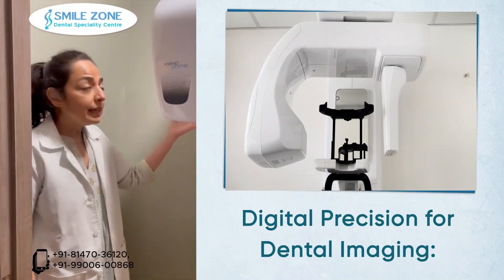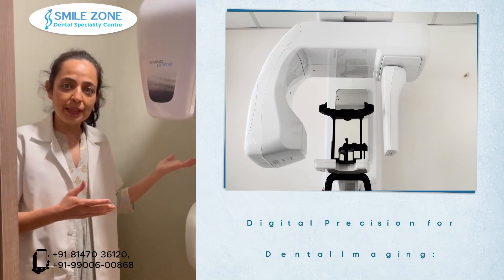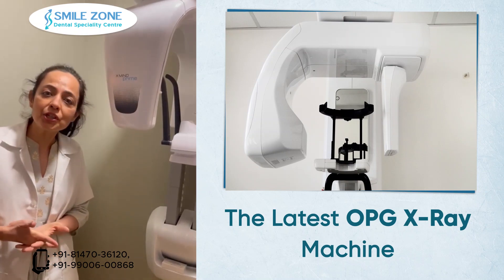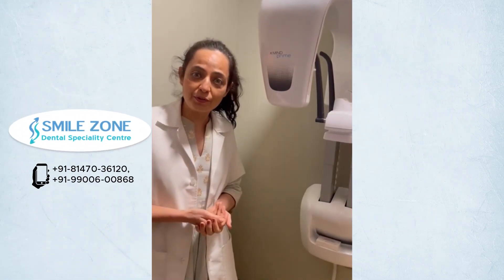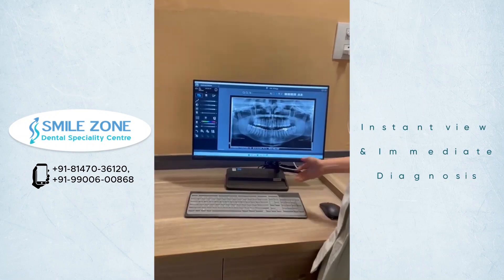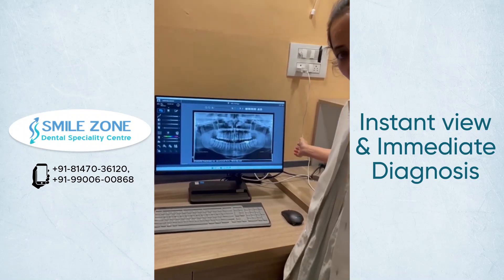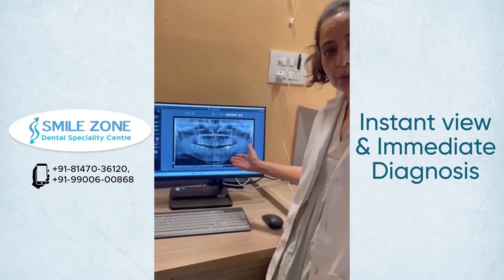This is a latest digital OPG X-ray. Hence there is no X-ray film, and you can instantly view the X-ray — this aids in immediate diagnosis by the dentist. Also, as there is no X-ray film, the radiation exposure of the patient is very less. As soon as the X-ray is done, it is immediately visible on the computer screen and the dentist can instantly diagnose the problem.